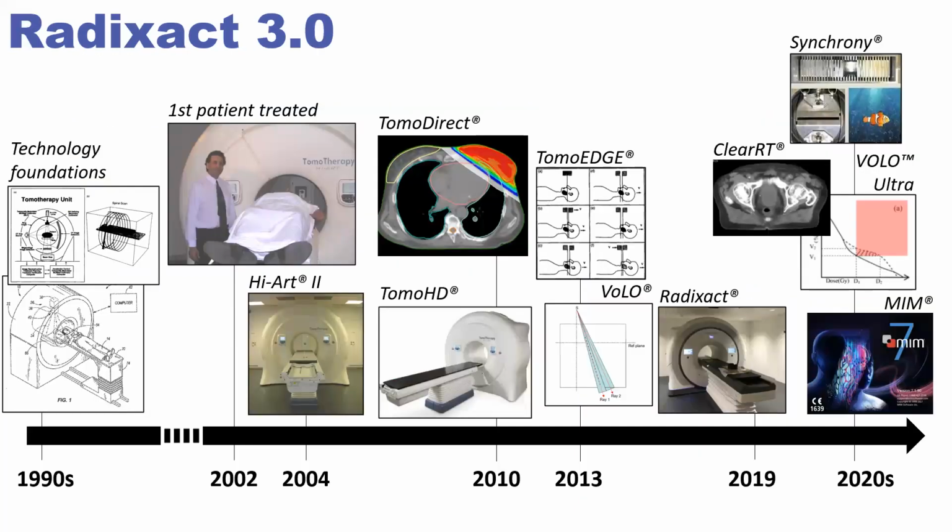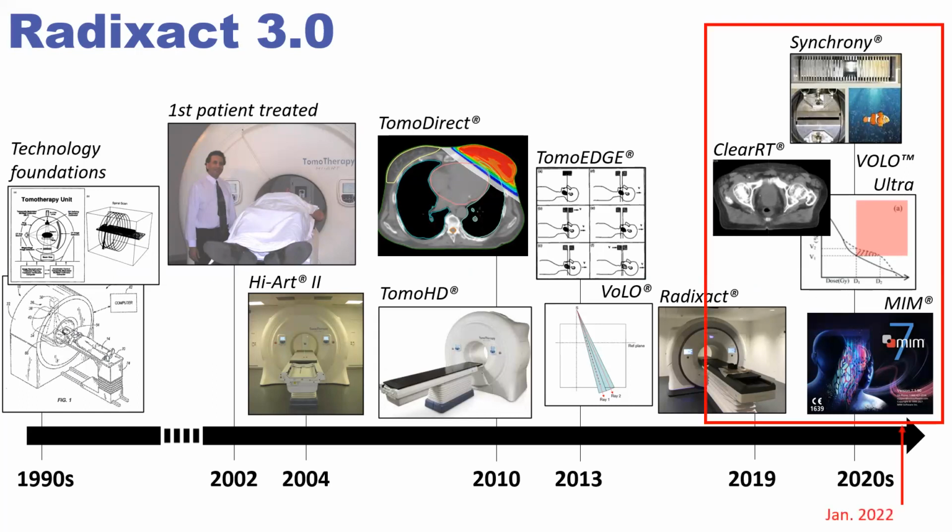For those of you who aren't aware of what tomotherapy is, I'm not going to get into a long story, but it's a LINAC mounted pretty much on a CT gantry that rotates with a couch that translates forward. And so you get kind of a helical treatment. There's been a lot of developments, but today's talk, what I'm going to focus on, obviously, for adaptive strategies is most of the recent software and hardware that's been added on to the platform.